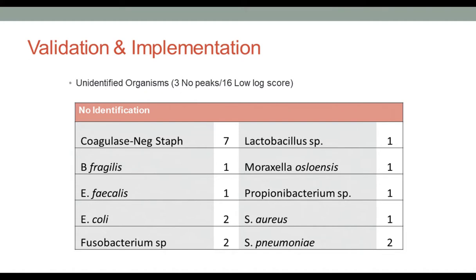By taking the blood culture from these bottles, we can do this rapid identification test that will give us the identification and the resistance mechanism in addition to that. And so we decided that would be the best way to go for the Staph aureus, because it allows us to do that additional testing just for the blood cultures that have Staph aureus. Now, for the gram-negatives, that's a little bit more of an issue, and we are looking at some other alternatives that, down the road, I think will help us give more rapid susceptibility or resistance markers for those.